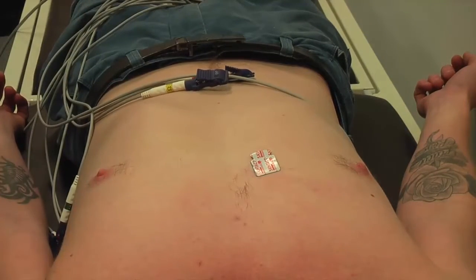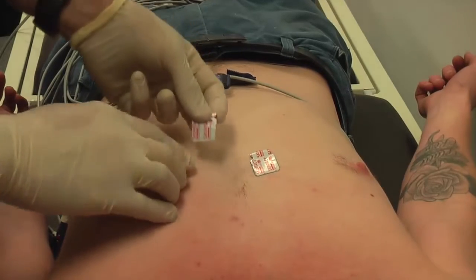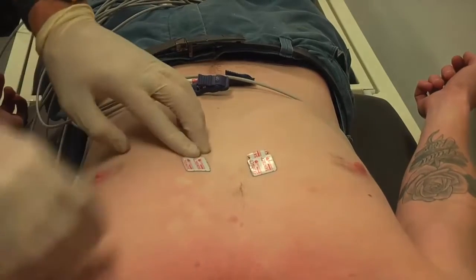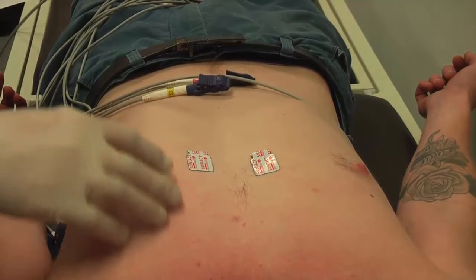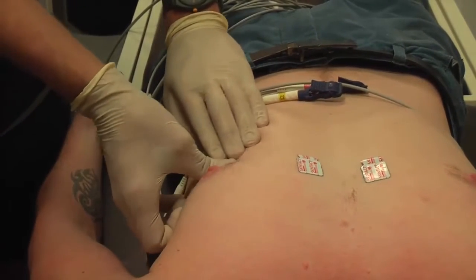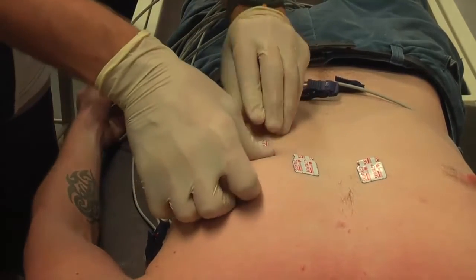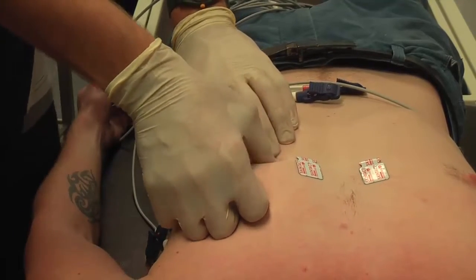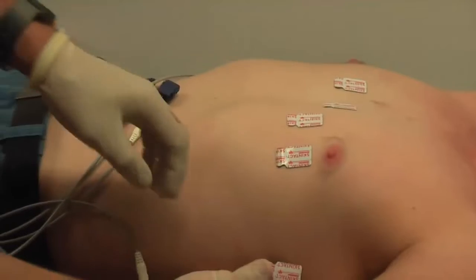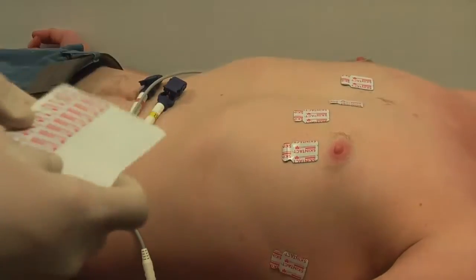To correctly place them on the skin, they should be put into position and then pressed down for a good second. This pushes the gel right out over the full surface of the contact area of the electrode.